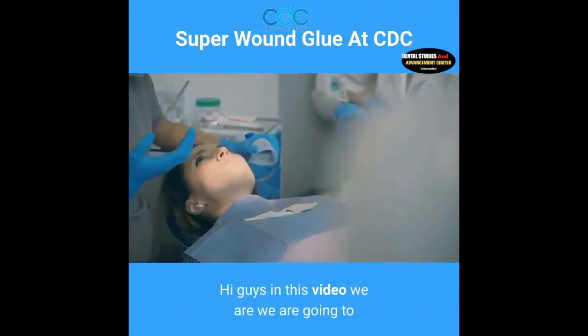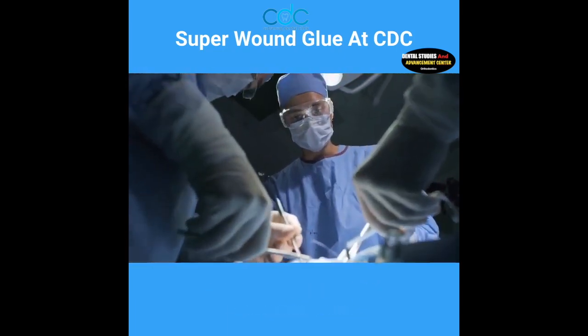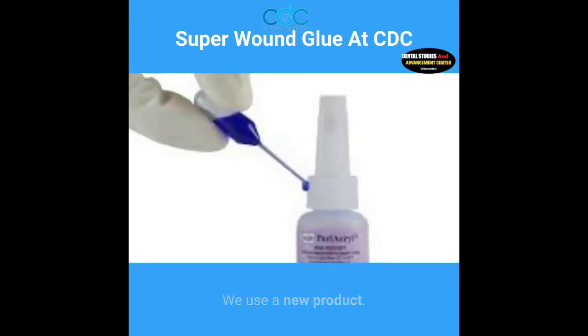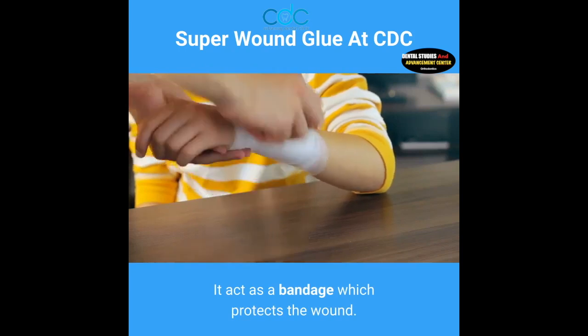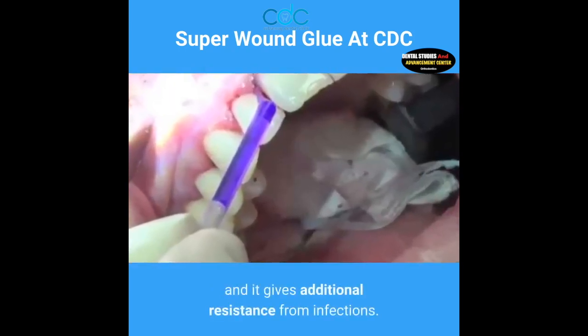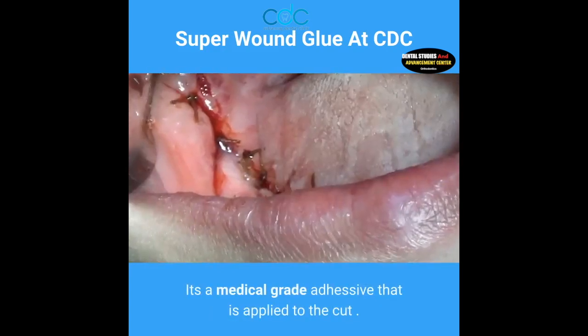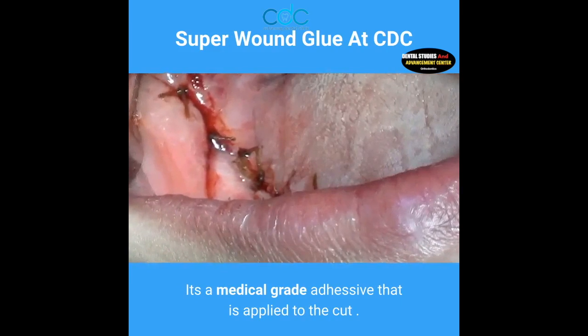Guys, in this video we are going to talk about how we finish our surgery cases. We use a new product. It acts as a bandage which protects the wound, so the liquid bandage protects the laceration and it gives additional resistance from infections. It's a medical grade adhesive that is applied to the cut.